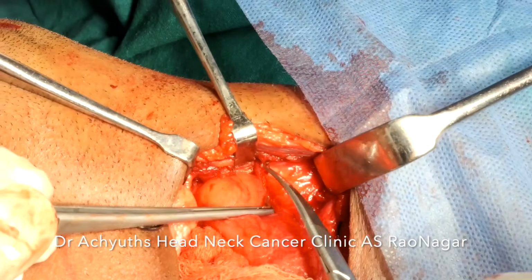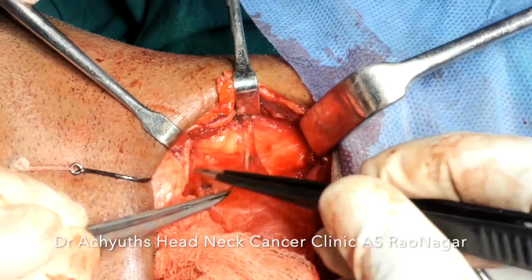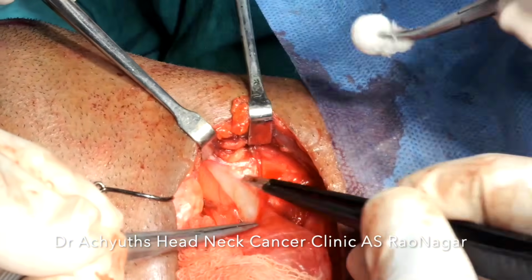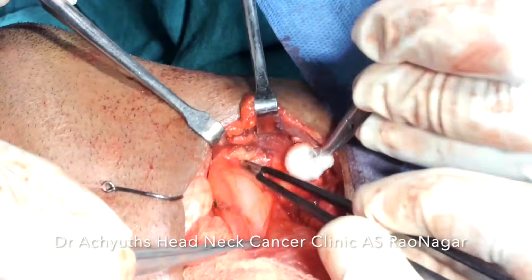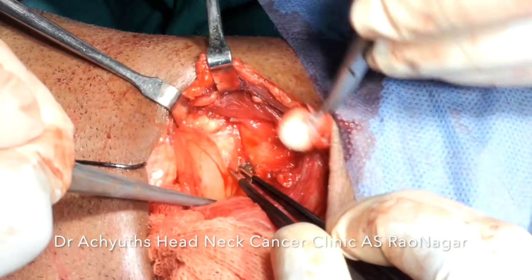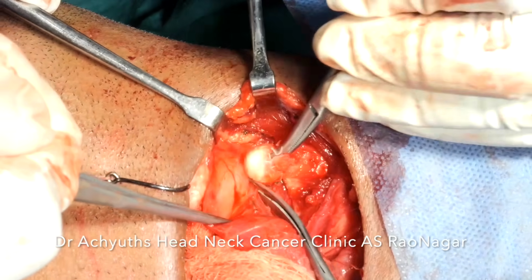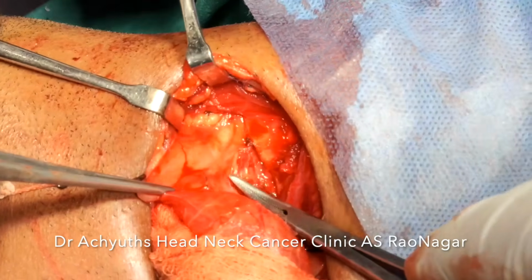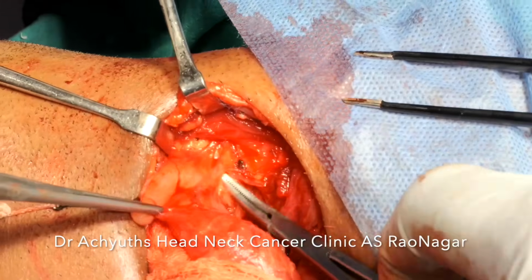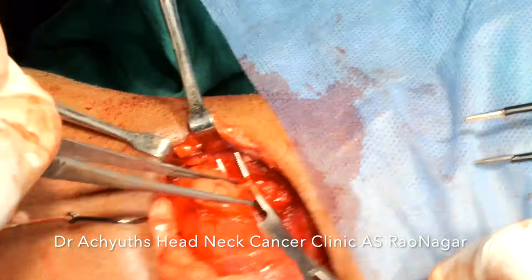Just before dividing, every time I palpated whether I am not cutting the vocal cord structures, because you can see that there is some insinuation of it inferiorly that is being divided gradually with the help of a bipolar cautery and cutting its attachment. With digital palpation, you can also identify the vocal cord structures and you do not damage the vocal cord here, the vocalis muscle.